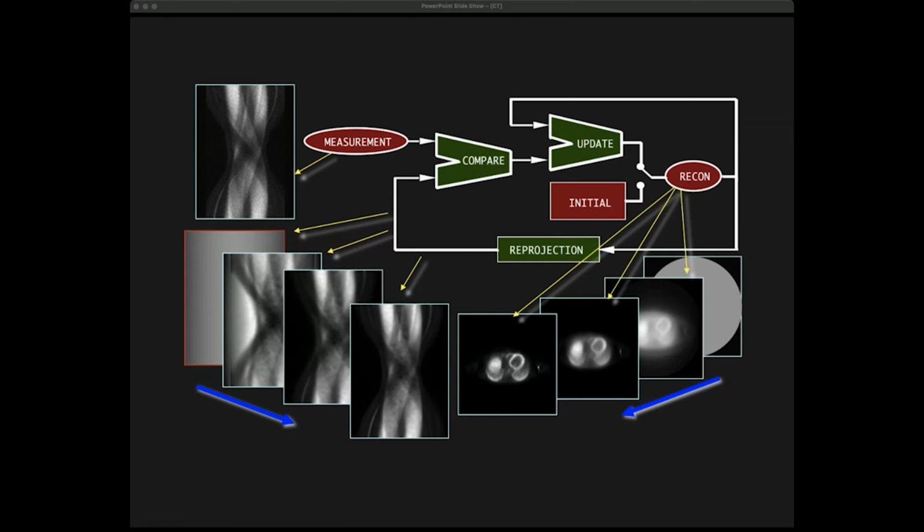So what I told you is that there are different ways, once we have the information from a projection, we measure the sinogram. So the sinogram is exactly what we measure. In order to then reconstruct the original distribution of attenuation coefficients, which is what we actually want, which is the image, the cross-section through the body, we have these different ways to do that. One is the regular back projection, which works nicely, but is a smoothed version, so it's not a correct version.